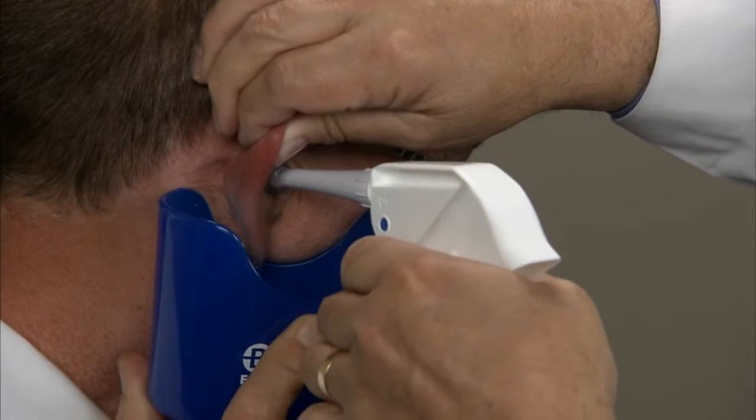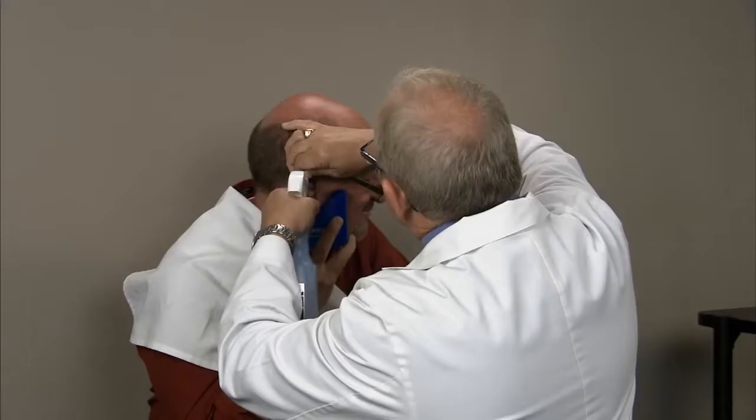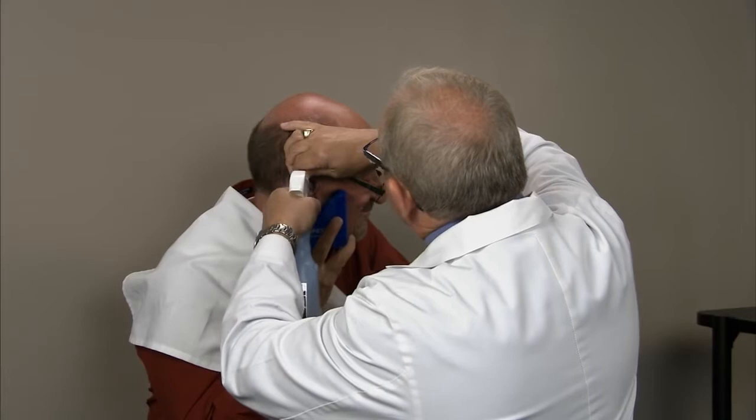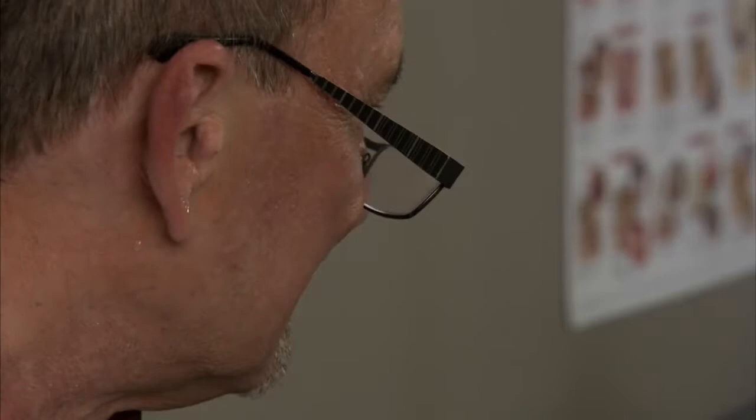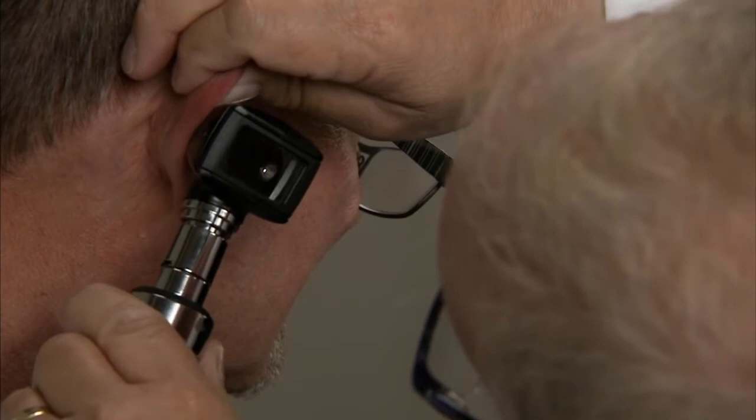And we got a lot of stuff coming out of the ear. So what I do is I give some nice, vigorous irrigation for about 5 or 6 shots. And we take a look in there, and there's quite a bit of stuff in there. We're going to now take our otoscope once again, and we've actually got quite a bit of wax that's come to the tip.